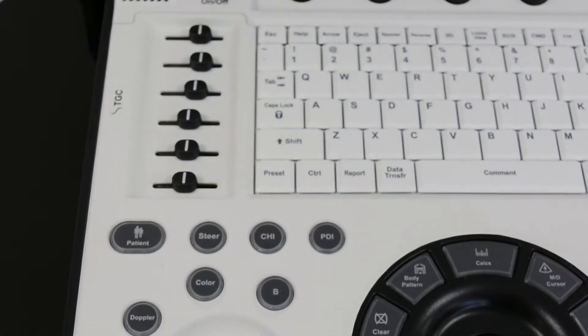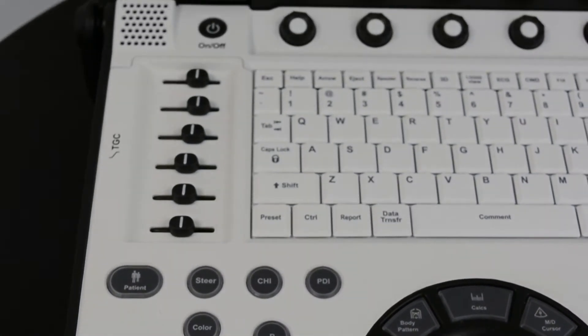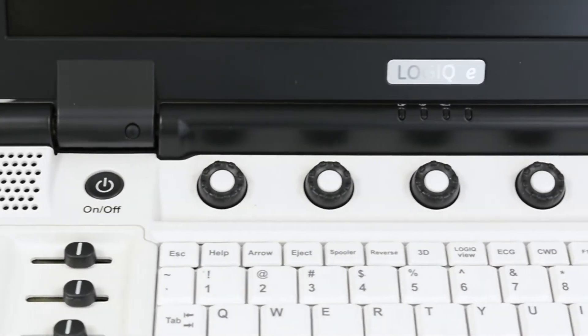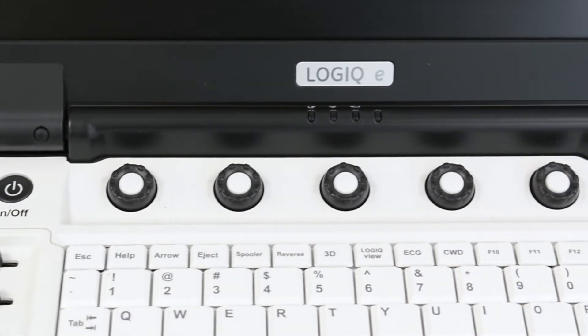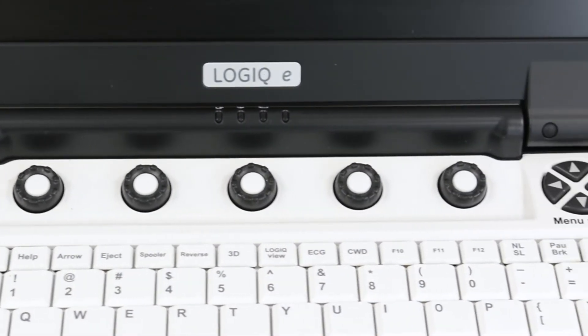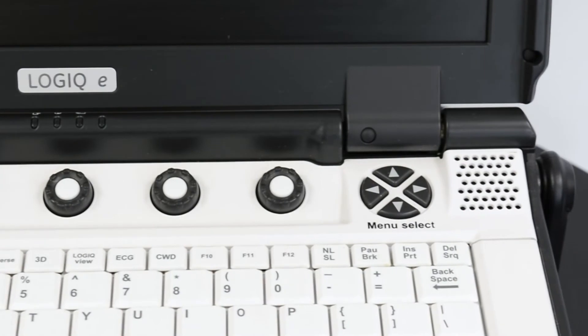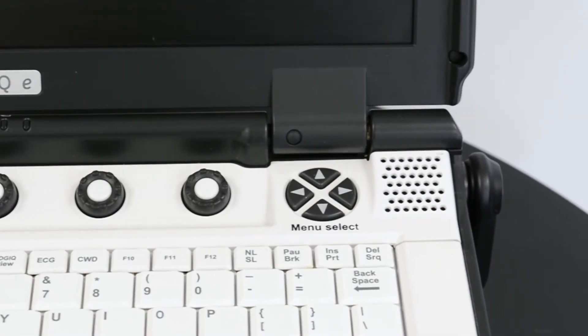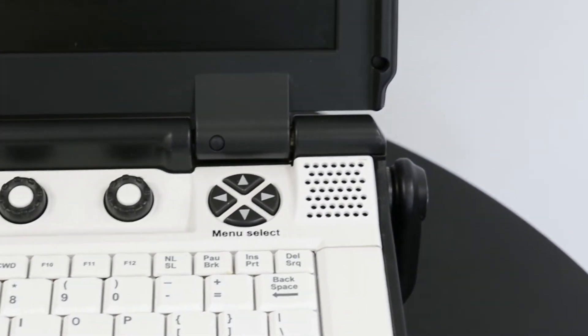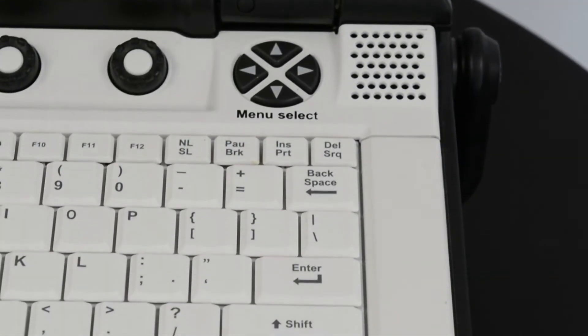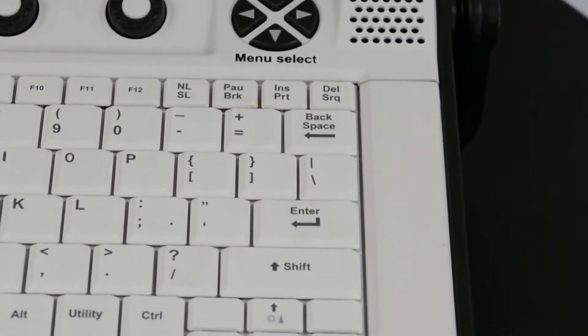Soma Tech International offers the refurbished GE Logic-E portable ultrasound machine up to 50% below the cost of new, with the same service and warranty contracts from the manufacturer.